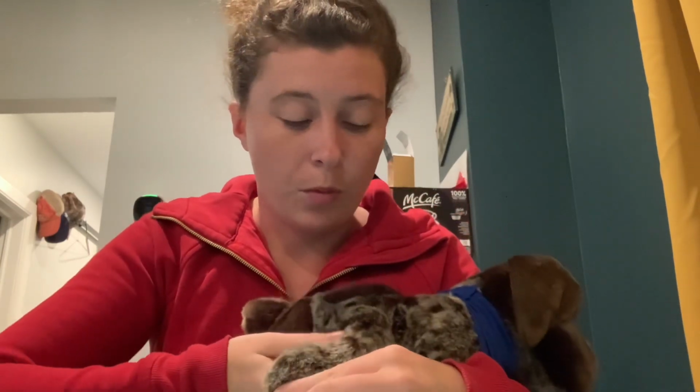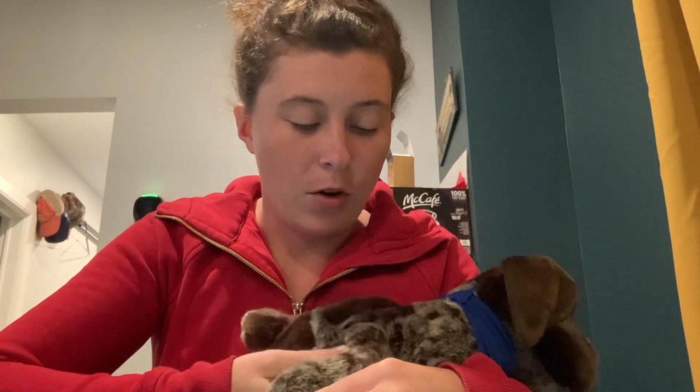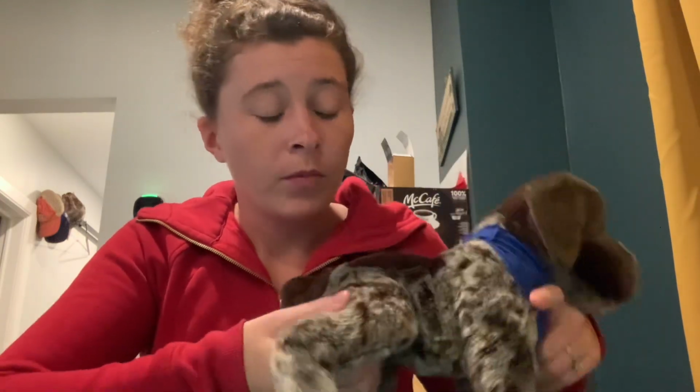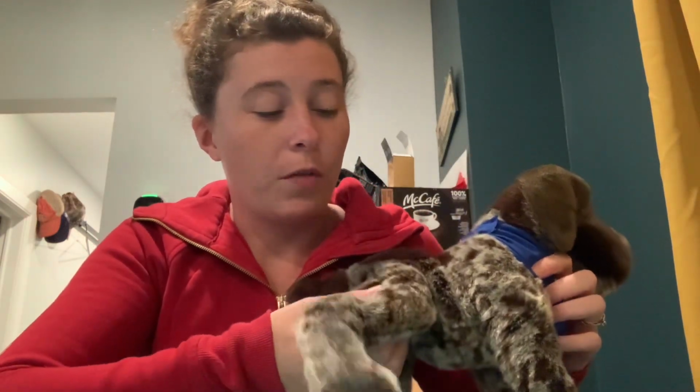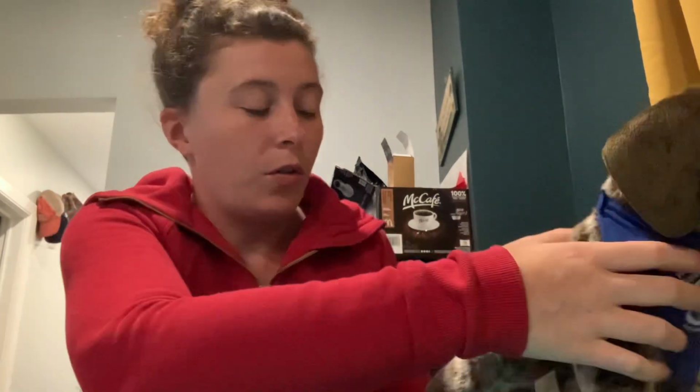Okay, now for the quadricep muscle, I'll show you on this leg here. For the quadricep muscle, we want to make sure that we're feeling the femur and we're pushing the quadricep muscle in a cranial direction, because again, we want to be careful of that sciatic nerve. We don't want to be touching that at all. So we're pushing with our thumb and our finger, getting the quadricep isolated. So I'm going to use this hand. I've got someone else holding the dog at the front there.